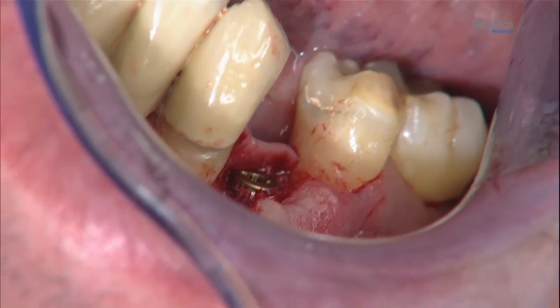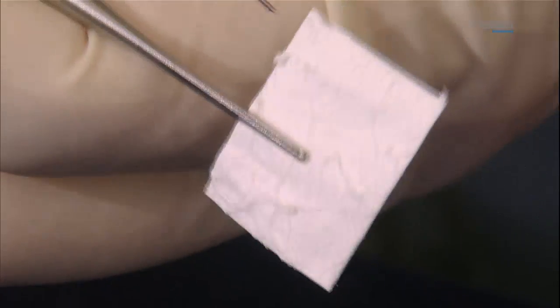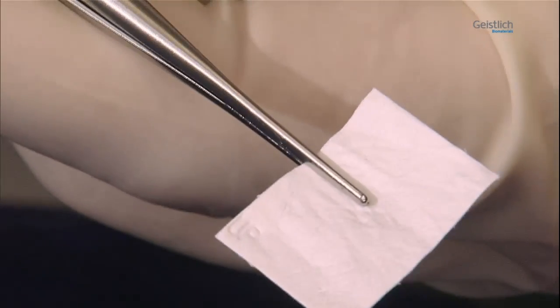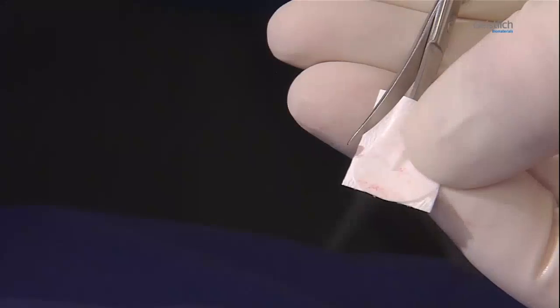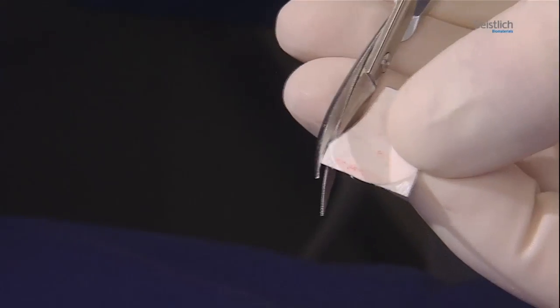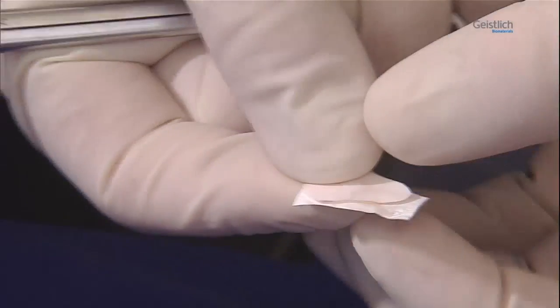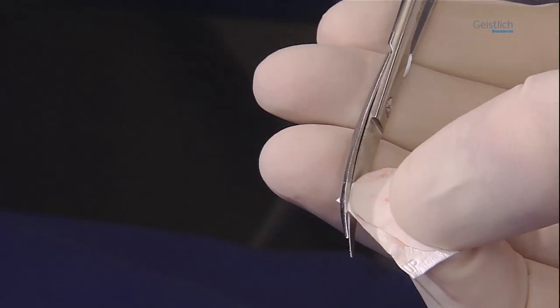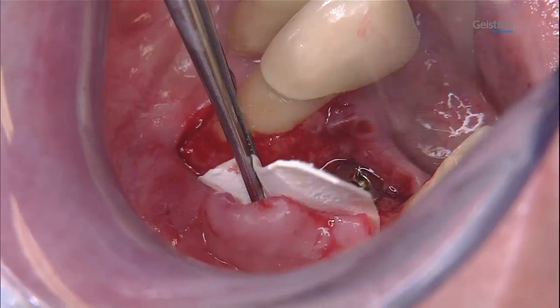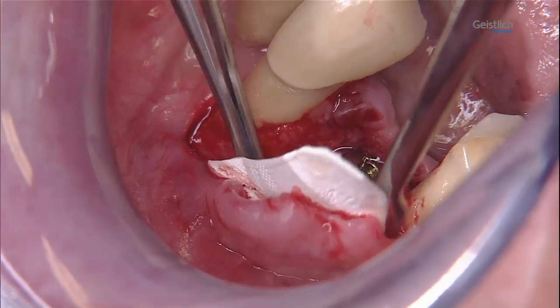The 16 x 22 mm Geistlich Bio-Guide has two differently textured sides. The outside of the membrane is marked with the embossed word UP. The shape and dimension of the template are now transferred to the membrane. Once the membrane has been cut to match the template, its broader base is first pushed under the mucoperiosteal flap. The collected autologous bone is applied in close proximity to the implant.